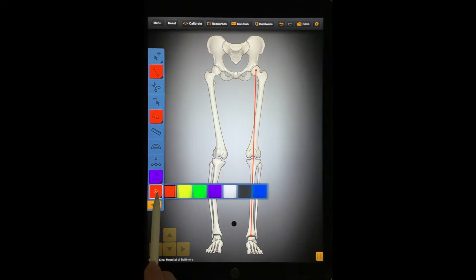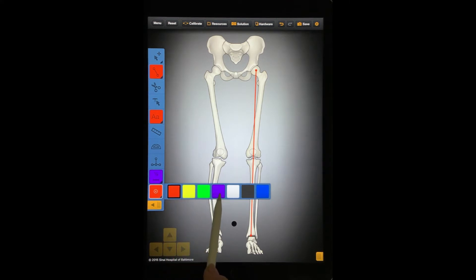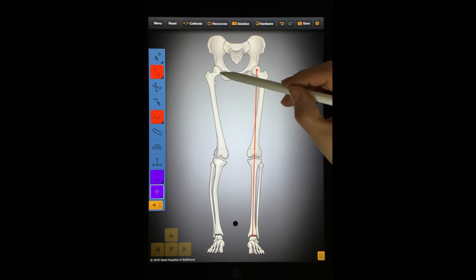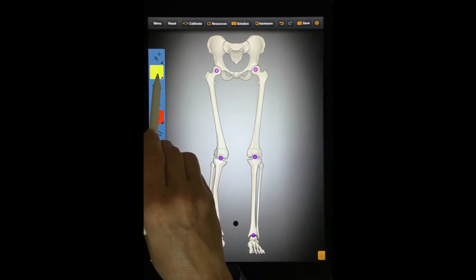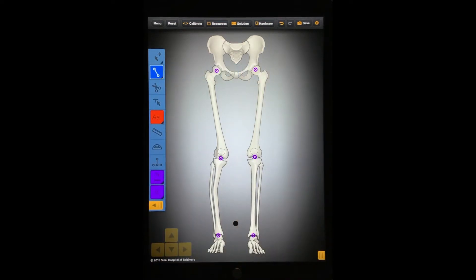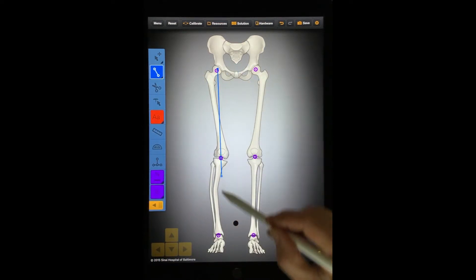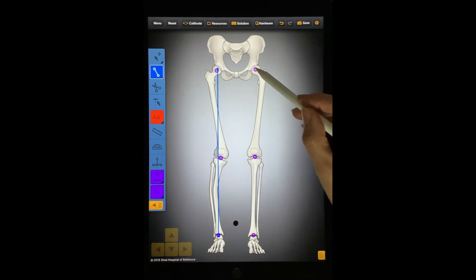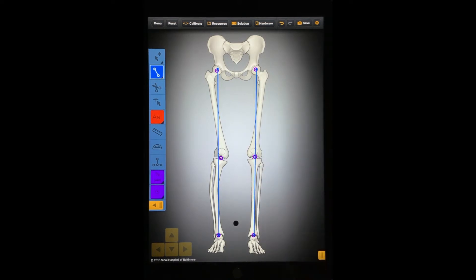The Draw Point tool allows you to draw points. Press and hold that button to select different colors. You can use the Line Tool button to draw lines. Press and hold the button to select the line color. The Select Move tools allow you to select an element and modify it by moving, angling, or resizing it.